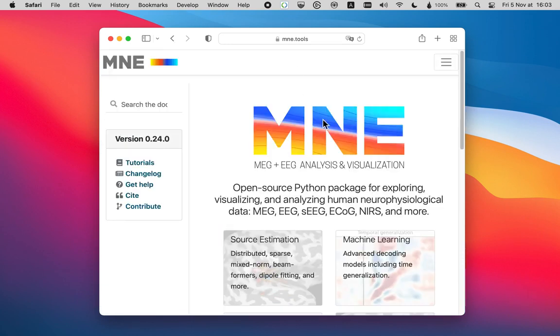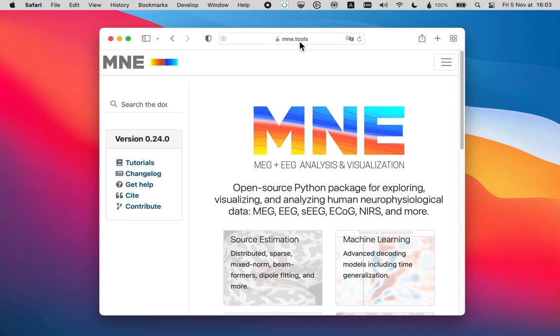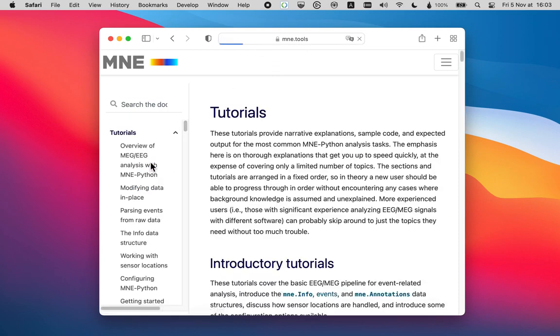So this is only scratched on the surface of what an MNE report can do. If you want to know more about this, go to our website, mne.tools. Click on tutorials.